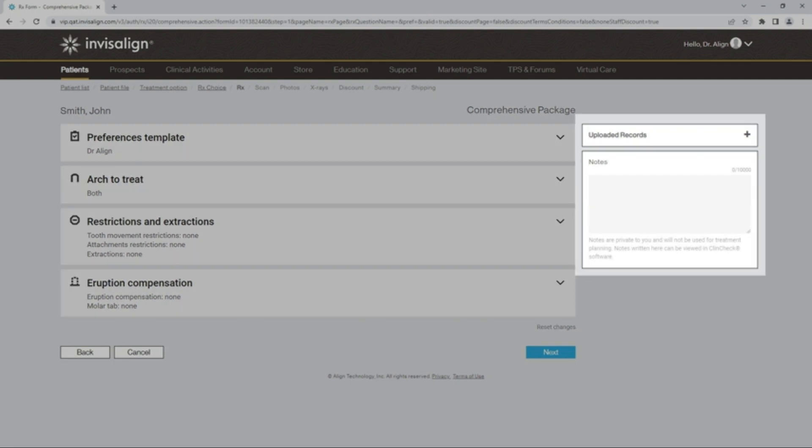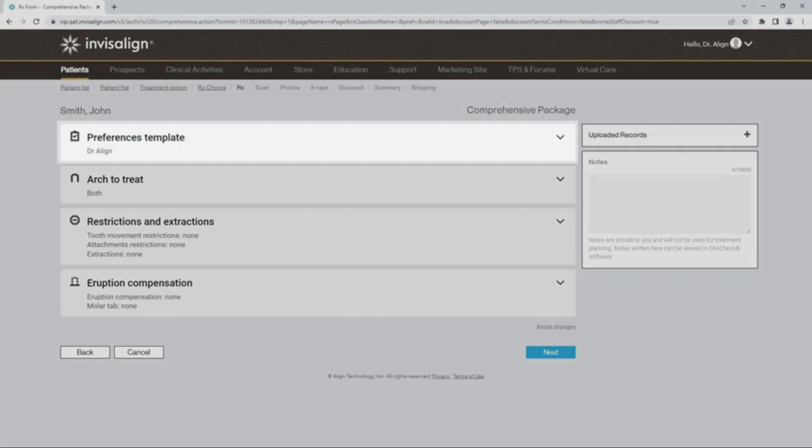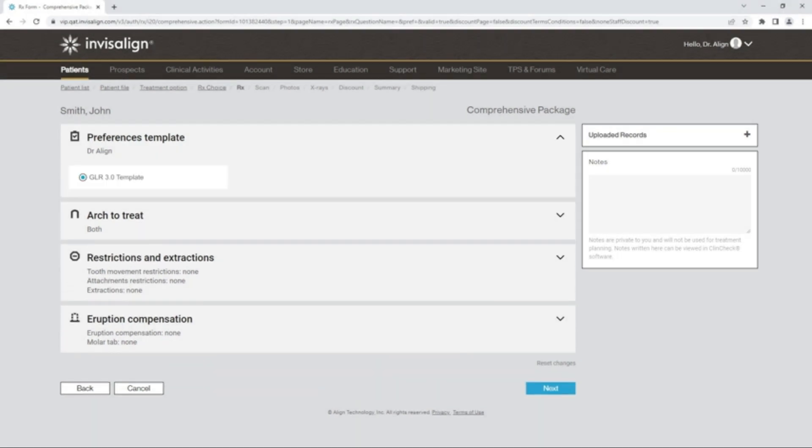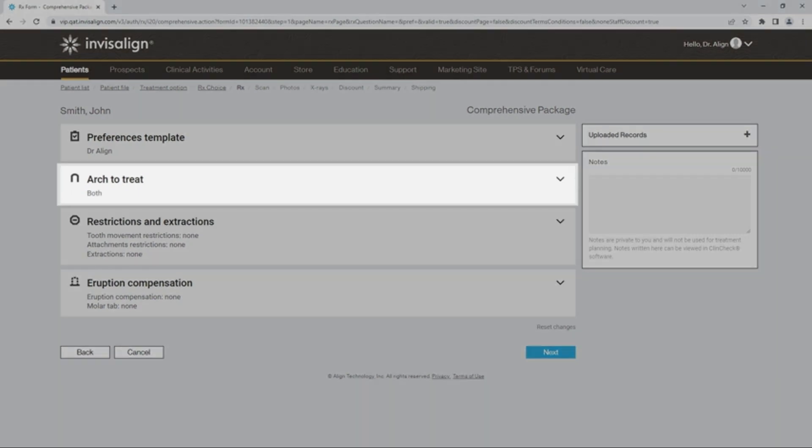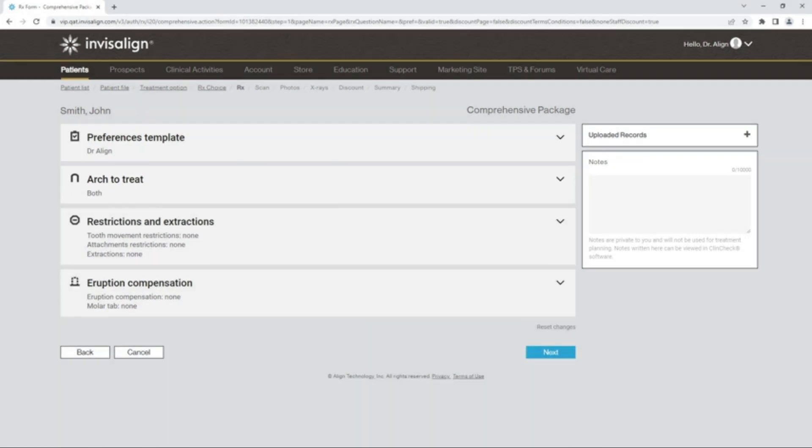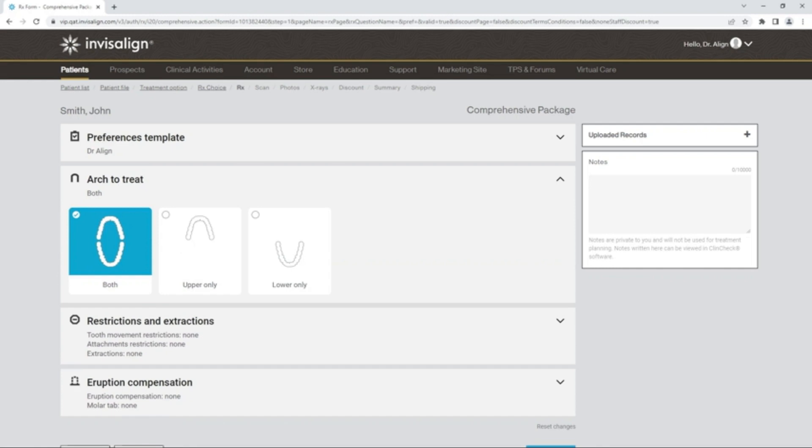A notes section is also available for adding patient-specific information. By clicking on Preferences Template, you can select the doctor's name and view the preference that will be applied to the case. The second question is the arch to treat, which is defaulted to both arches. You can modify to a single arch as per the patient's needs.